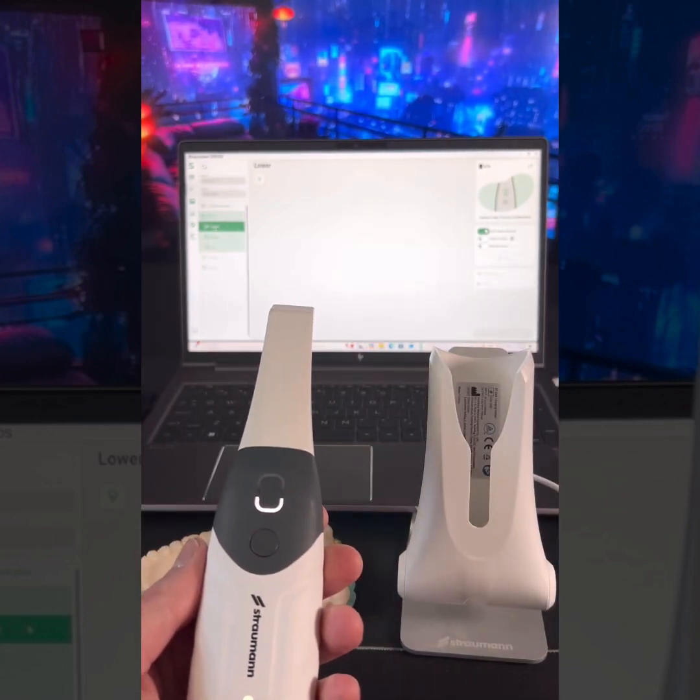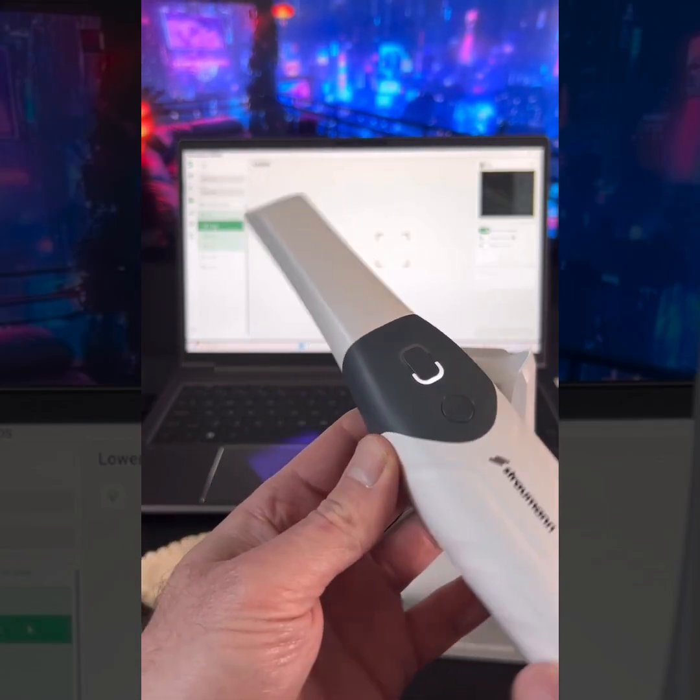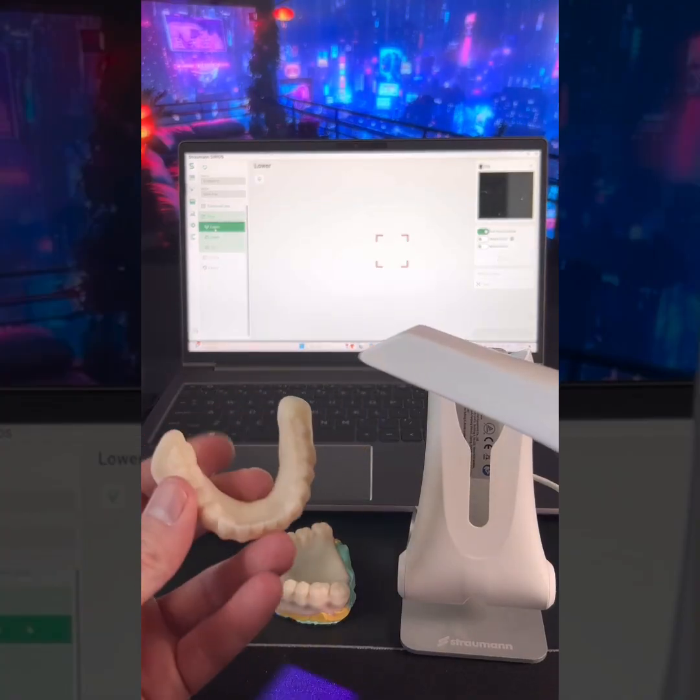So I'm going to scan lower first so the scanner is ready. To scan, you just push this button and you're good to go. So let's get our lower denture and let's just see how this thing does.